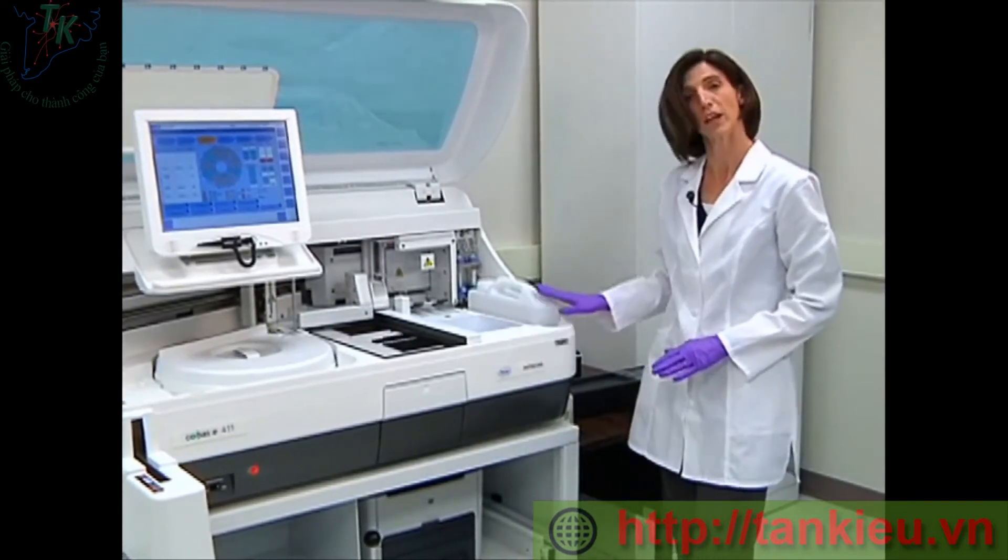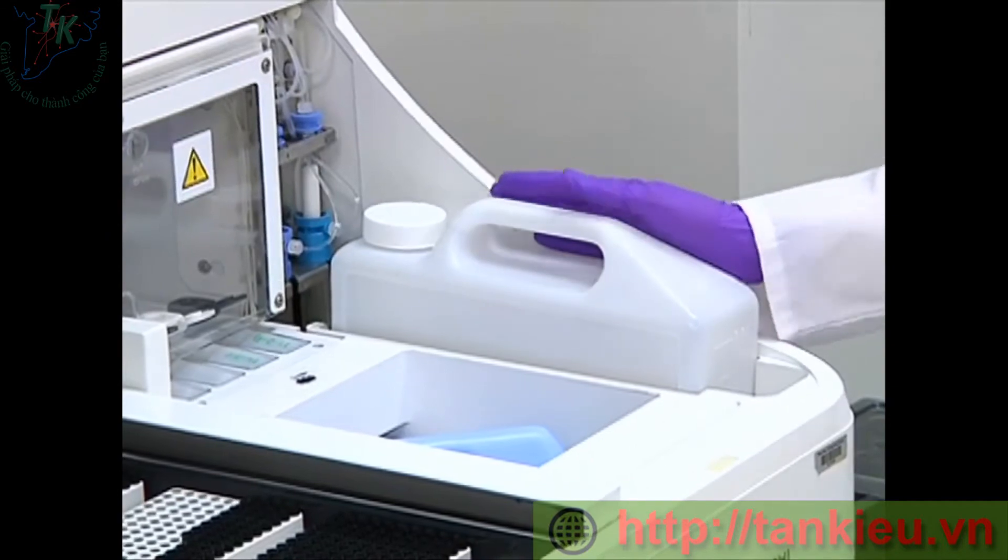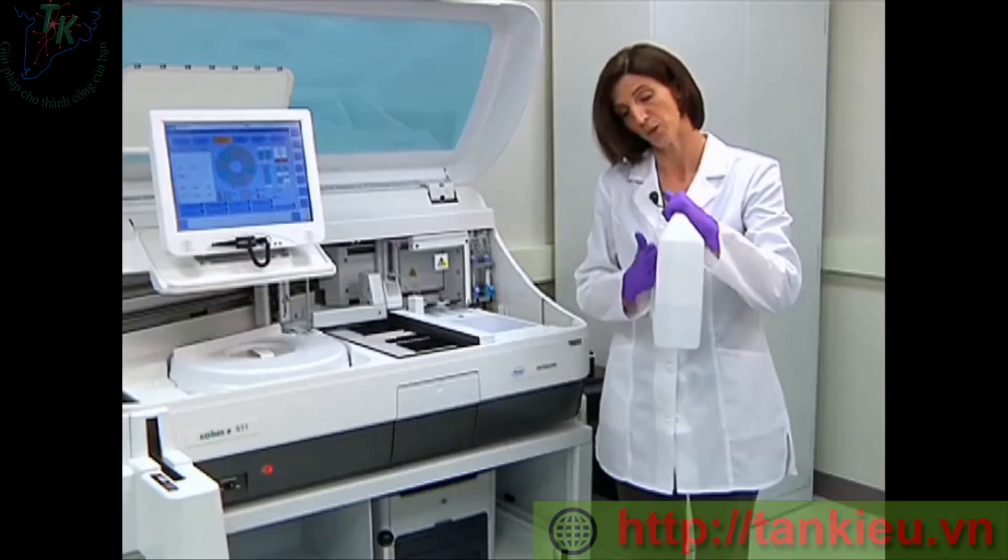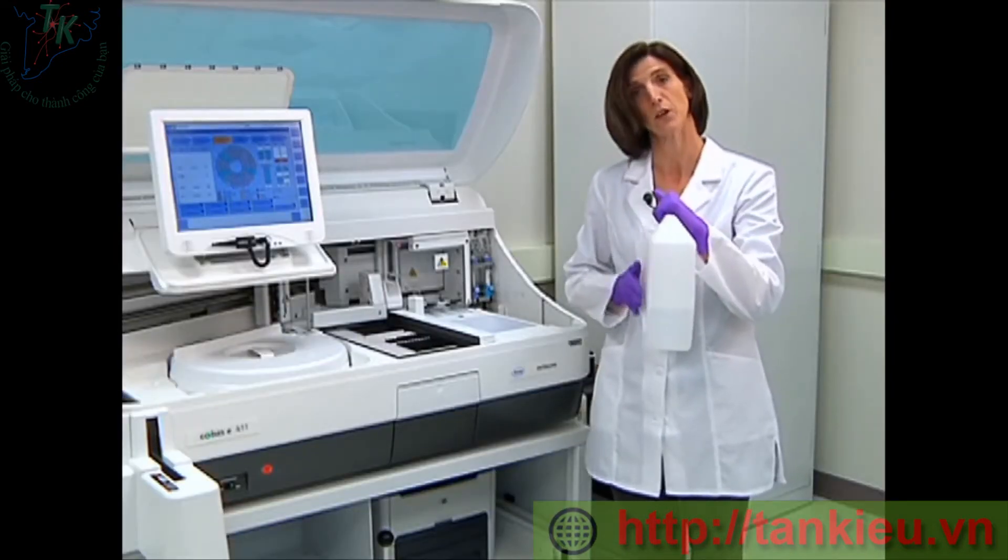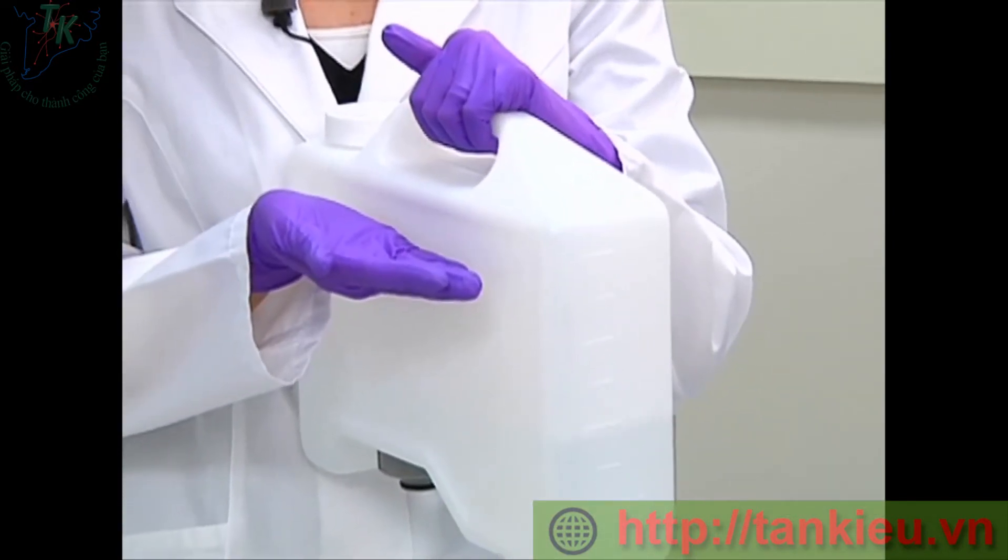Next, we will take a look at our water and our waste. The system water, located on the right-hand side of the instrument, needs to be filled to the 3-liter mark. So if there's any water remaining in the container, we would dispose of that water and then fill to the 3-liter mark with DI.